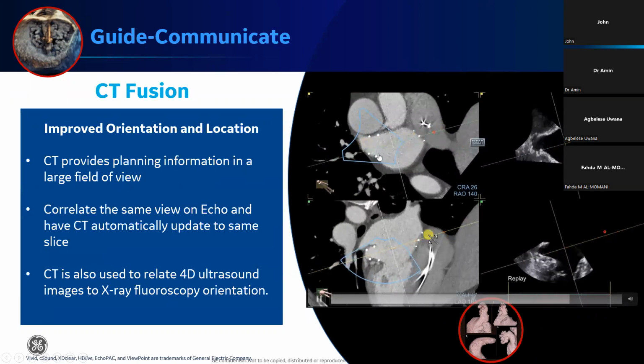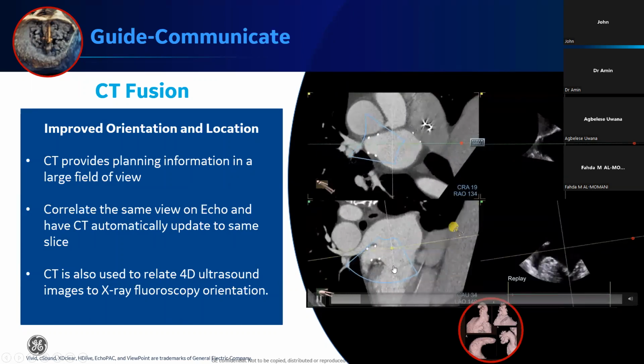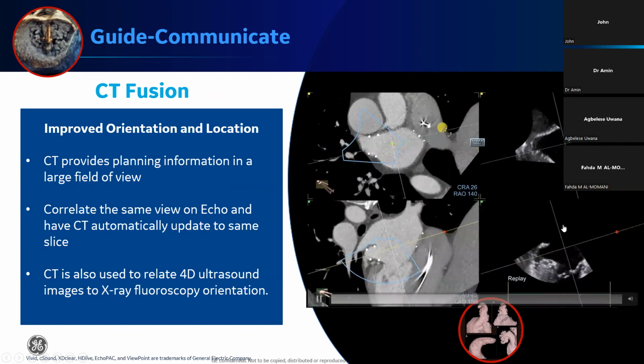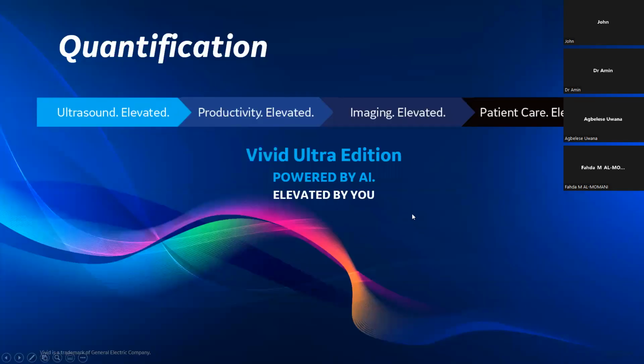And you see the slices, the maximum width of the appendage, and then in long axis, and coronal, and even in short axis, if you position the white line differently, then again you can see the device as it's being advanced, and follow it through.